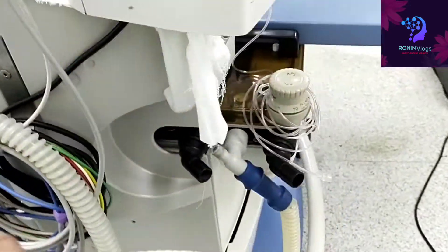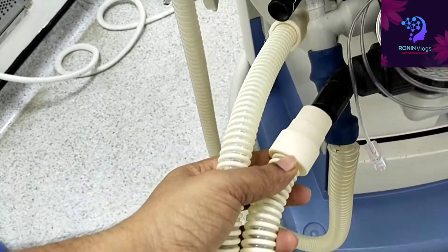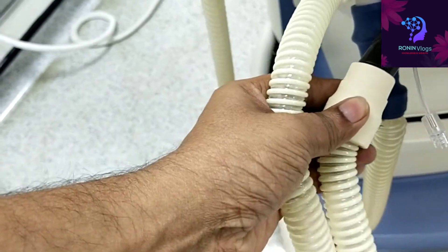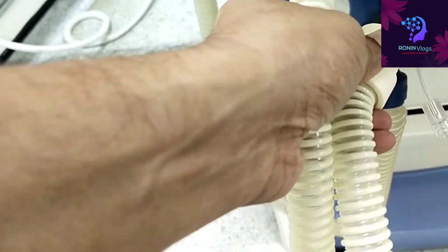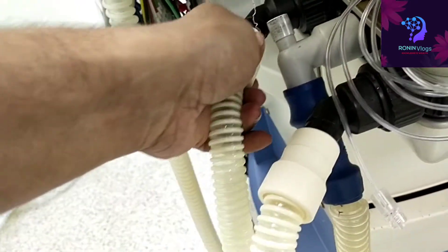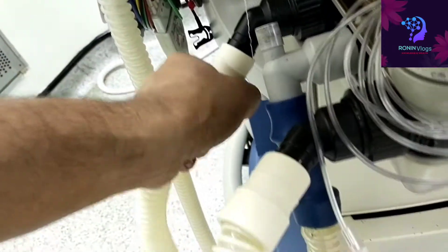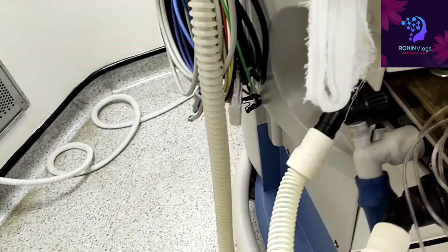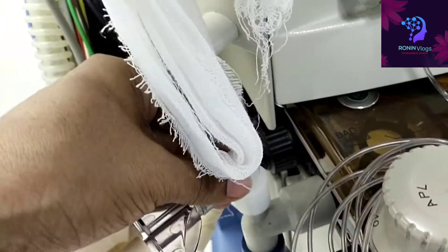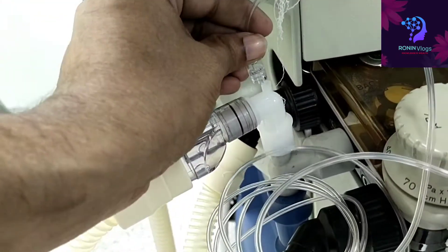This is the tubing we are going to use for the self-test purpose. We need to connect here like this, and at the end we need to occlude — yes, like this. Then the connection from the water trap — this we need to connect on the top, and just rotate to secure it.